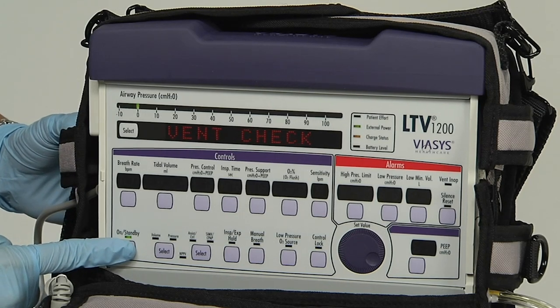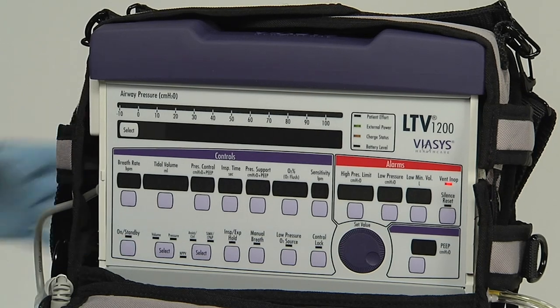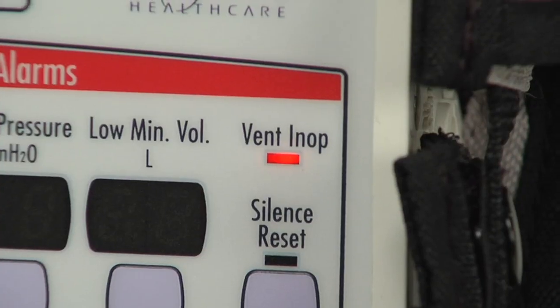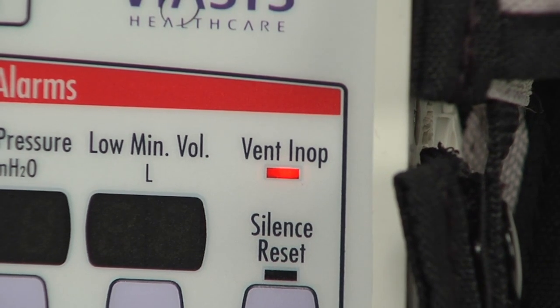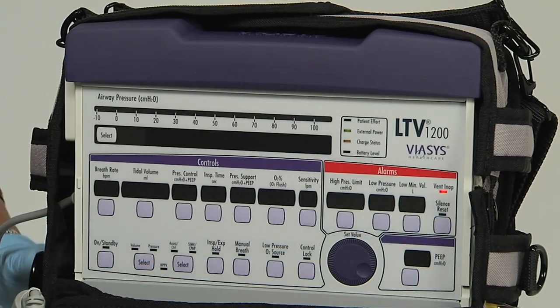Do not push the silence/reset button. Observe the ventilator for 15 seconds and listen for the alarm tone for the full 15 seconds. Watch the vent in op LED for the full 15 seconds. After the 15 seconds, silence the alarm by pressing the silence/reset button and verify a confirming audible chirp occurred after the alarm was silenced.